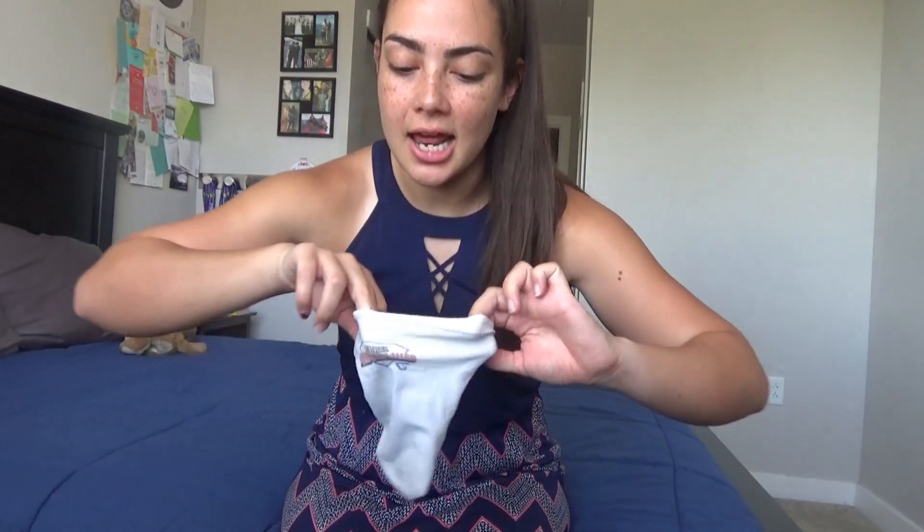The thing I want to tell you guys about today is my favorite amputee thing in the entire world, and it is the underliner. There are a lot of different types of sweat socks, and what these are is — as the name explains — it goes under your liner.